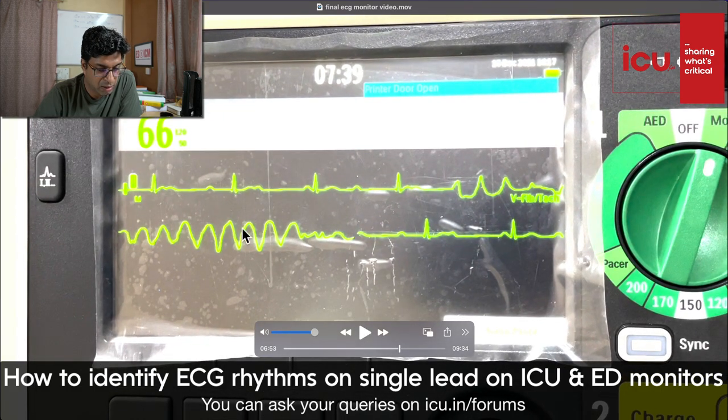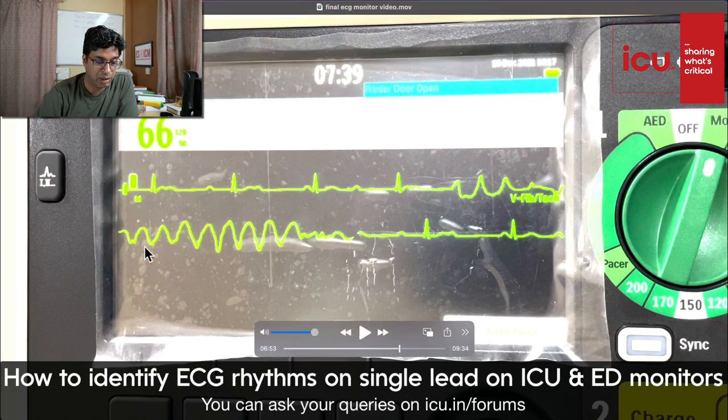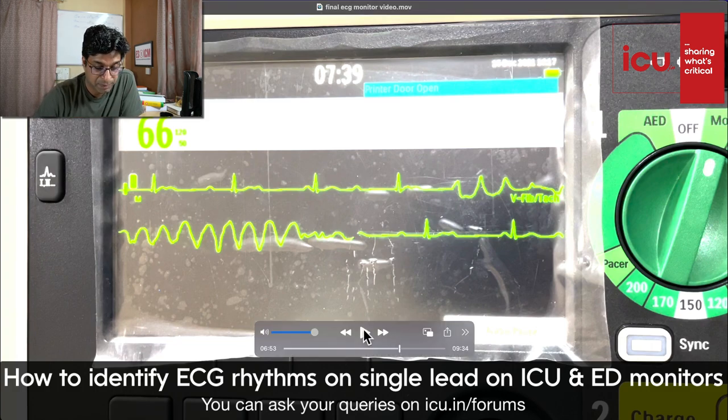Okay. This is, I think, torsades de pointes. This is a multifocal tachycardia. What you can see is that the tachycardia axis is changing in the ventricle, and you see the complexes getting up and then getting down. It is not VF. VF is a very fibrillating sort of rhythm. Torsades de pointes is a broad, axis-changing tachycardia. It's a multifocal ventricular tachycardia, torsades de pointes. Very deadly. You need to shock the patient. Magnesium is usually the thing to which these people respond, but you need to identify it.